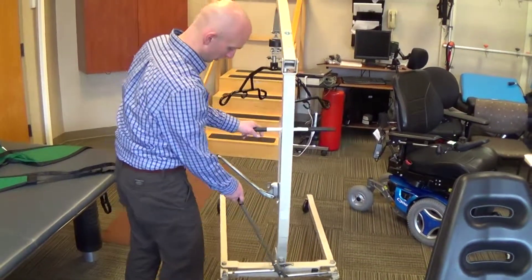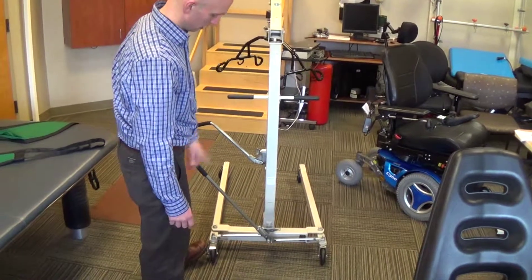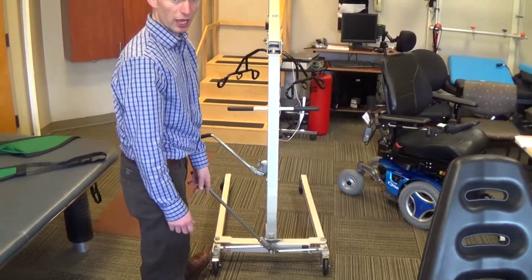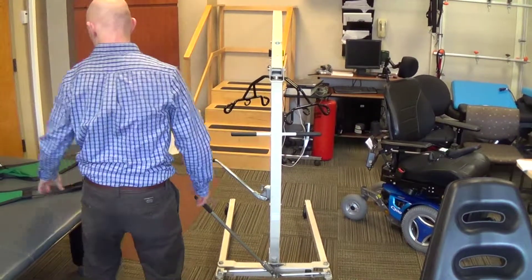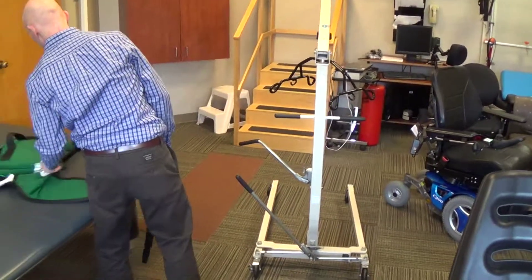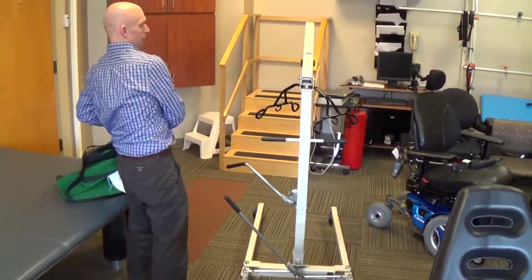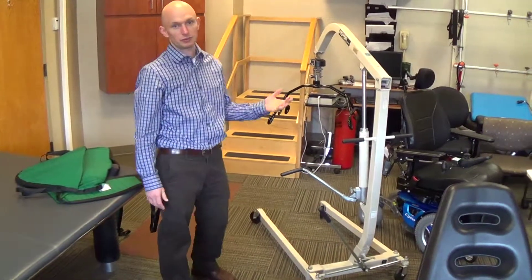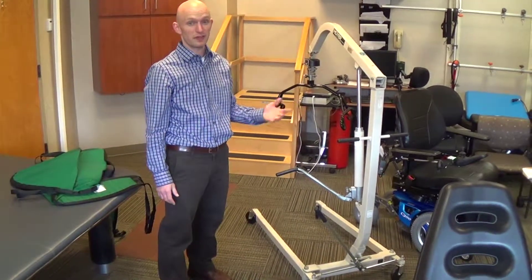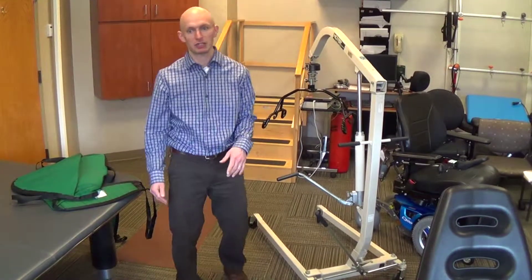There are typically brakes on the rear caster wheels. You can use the lock to stabilize the hydraulic patient lifter. These lifts are frequently referred to as Hoyer lifts, but that is just a name brand — they are technically hydraulic patient lifters.